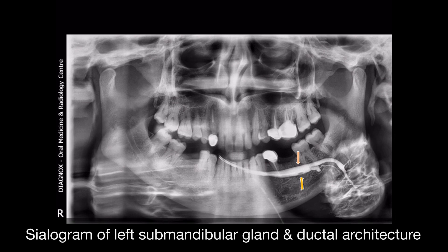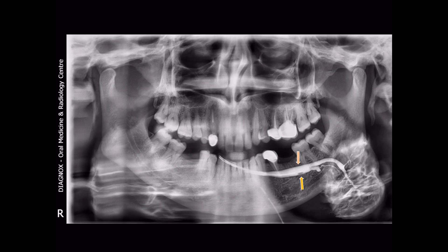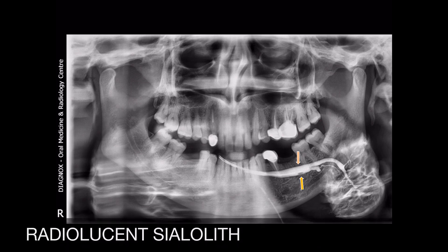The duct is more than 6 mm wide in that particular region. Another interesting finding is the presence of an irregular-shaped radiolucency adherent to the lower portion of the duct, called a radiolucent sialolith. Around 50% of parotid sialoliths and 20% of submandibular sialoliths are poorly calcified, making them very difficult to diagnose using plain film radiographs. This radiolucent sialolith is the cause of consistent pooling of saliva in that region, leading to recurrent salivary gland infection and pain.